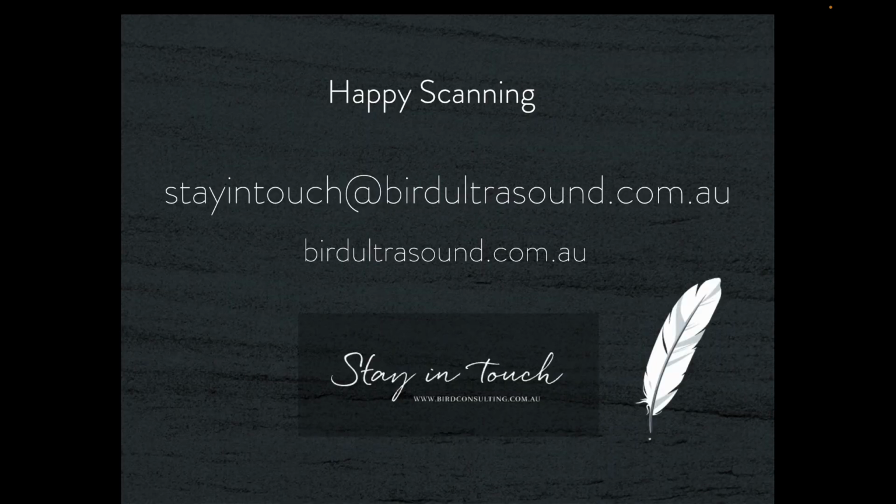It just goes to show that even when you've done thousands of shoulder ultrasounds, you're still going to see something unique the next time you put the transducer on a patient's skin. Isn't that one of the wonderful things about the job?